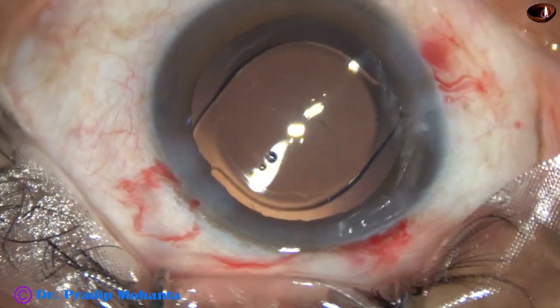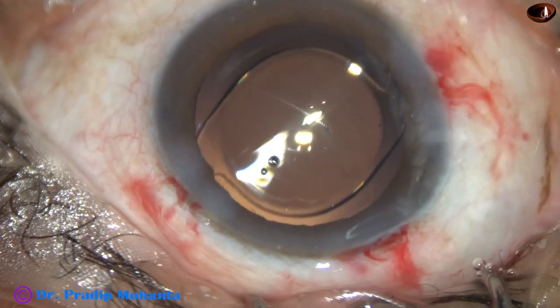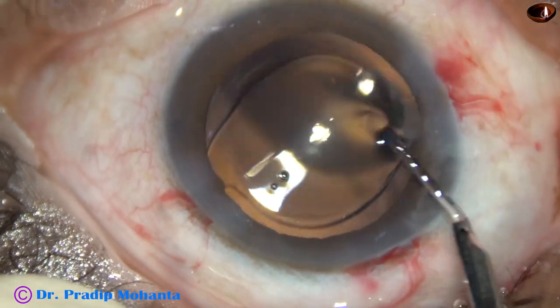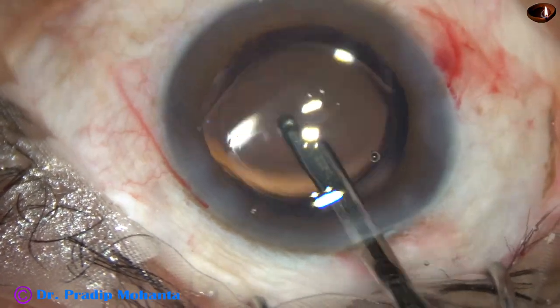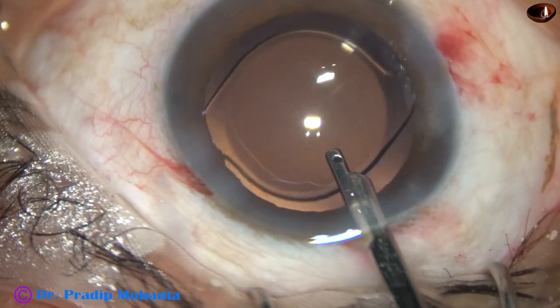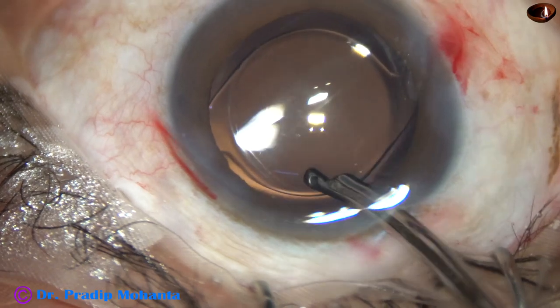Now the visco that is sticking to the corneal endothelium is going to be removed. A gentle stream of BSS is passed towards the cornea and the visco gets dislodged and comes out. We are towards the end of the surgery.